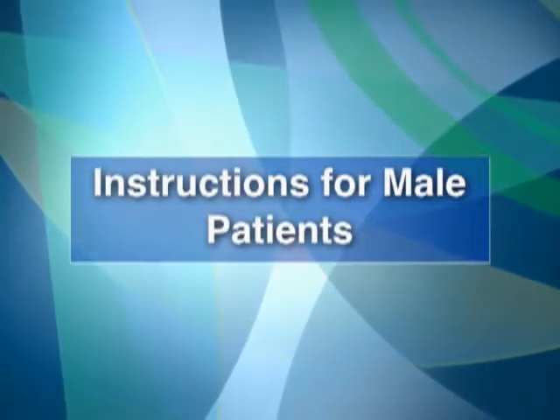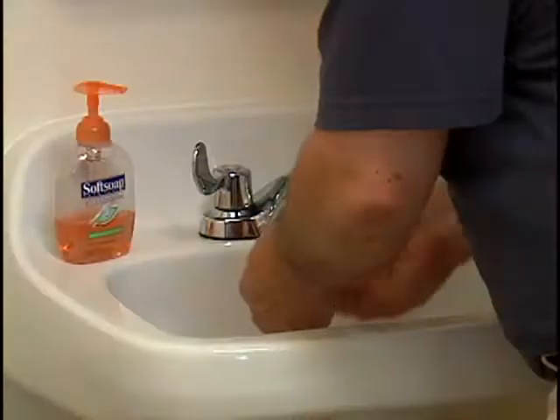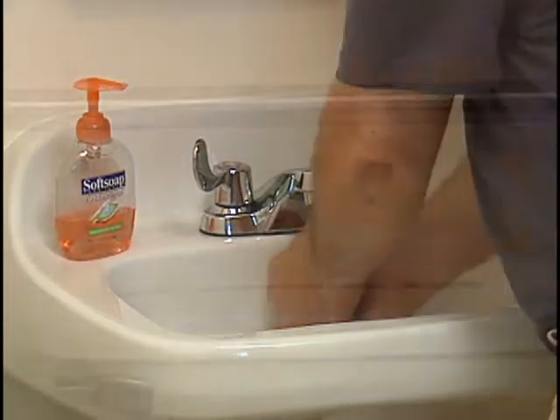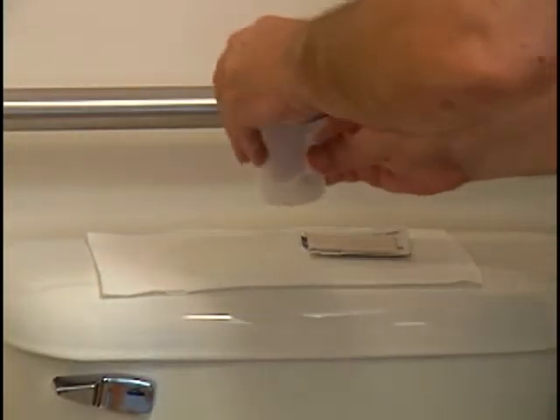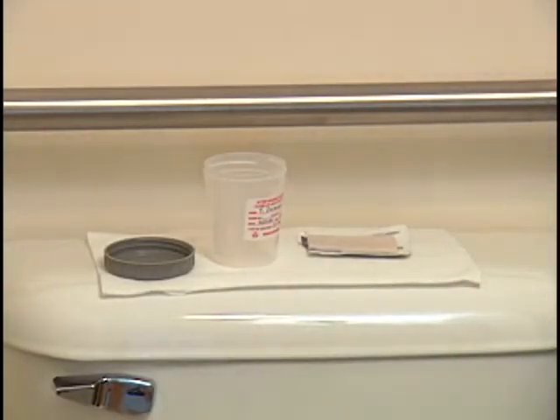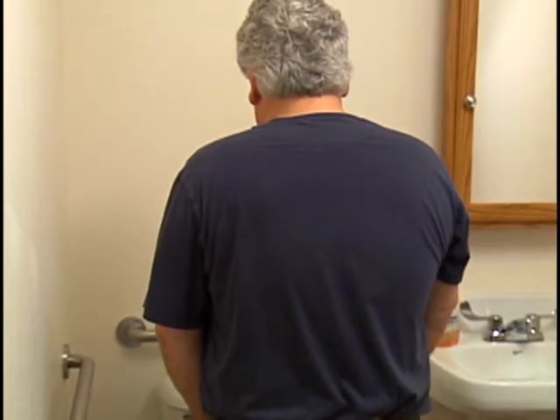Now the medical assistant will instruct a male patient how to collect a clean catch specimen. Wash your hands. Open the towelettes and remove the lid from the specimen container. Pull down your undergarments and stand in front of the toilet. Retract the foreskin of the penis if you are uncircumcised.